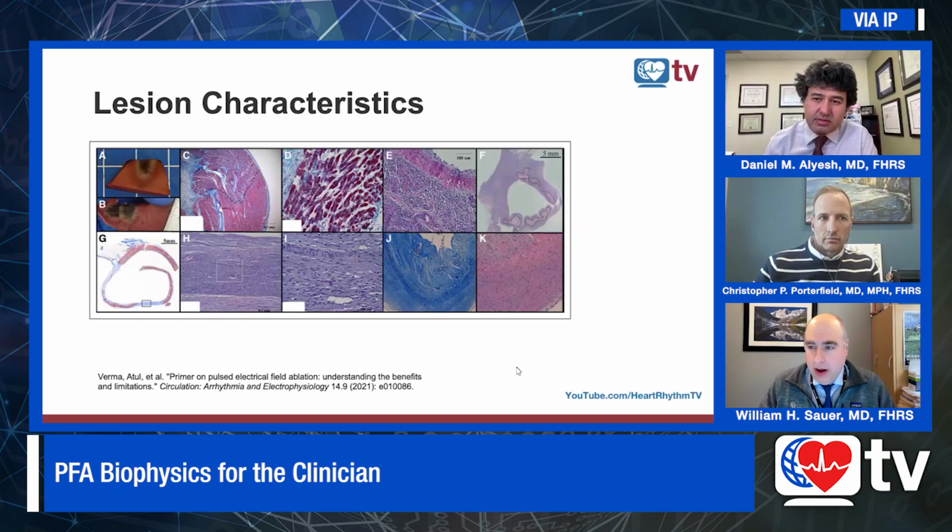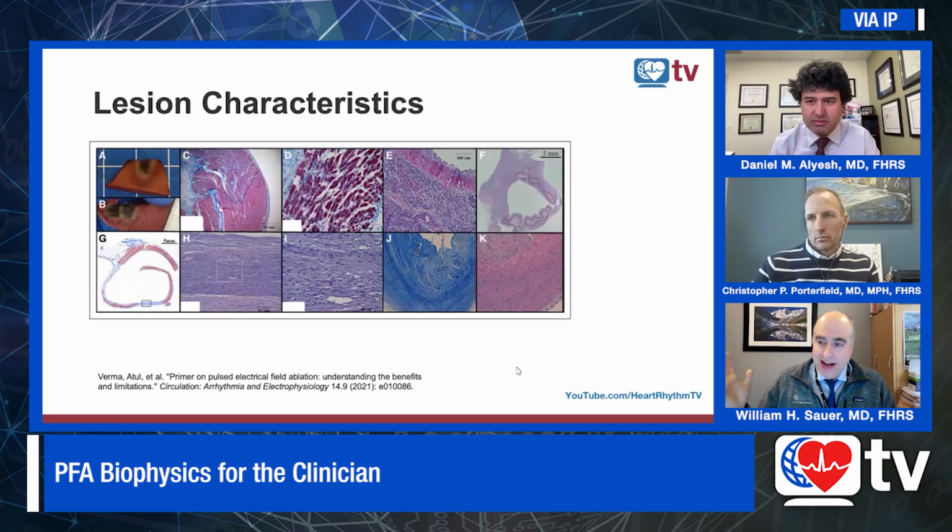Yeah, I agree. I will say remapping, most of the time, doesn't give me information. It just gives me confirmatory information. But every now and then, outside the left superior pulmonary vein, I'll realize, well, maybe I didn't have as good contact as I thought I did. So in terms of remapping and trying to understand whether or not you need to give additional applications, I don't think it needs to be 20 minutes. I think you could do that in 1 minute because you either got it or you didn't. And if you got it, then the waiting period is, as you said, 3 hours. It's not going to be practical. So yeah, it's worth looking and making sure that you got what you need. But I don't think that we can apply the same waiting periods or other tricks that we were using with RF ablation.